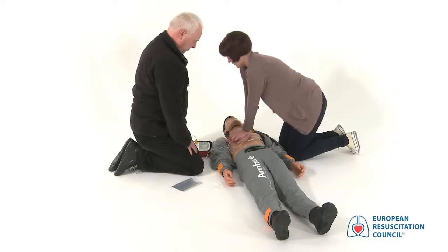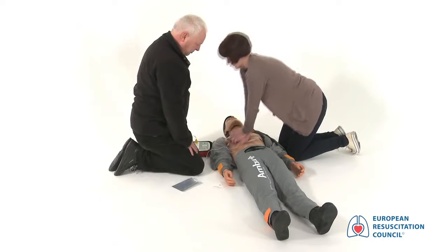The second person should direct the first person on when to stop and restart CPR. The second person should take over delivering CPR after 2 minutes to prevent fatigue. Both rescuers exchange roles every 2 minutes.